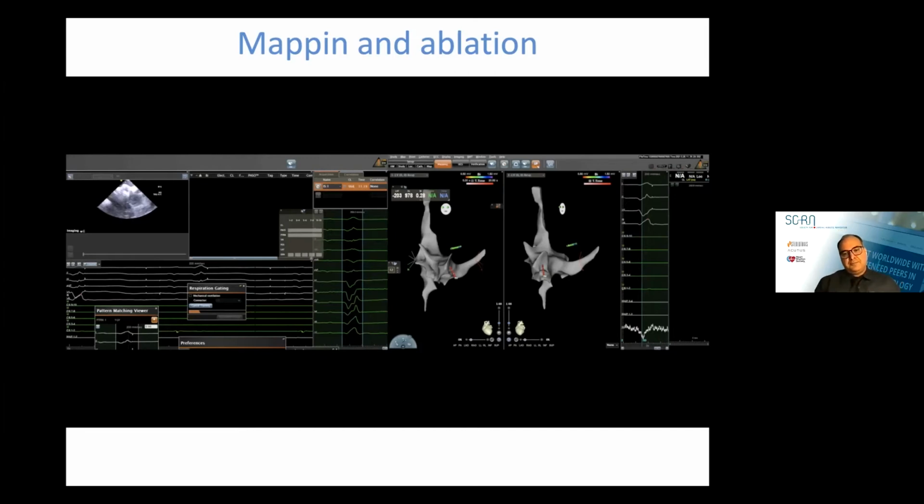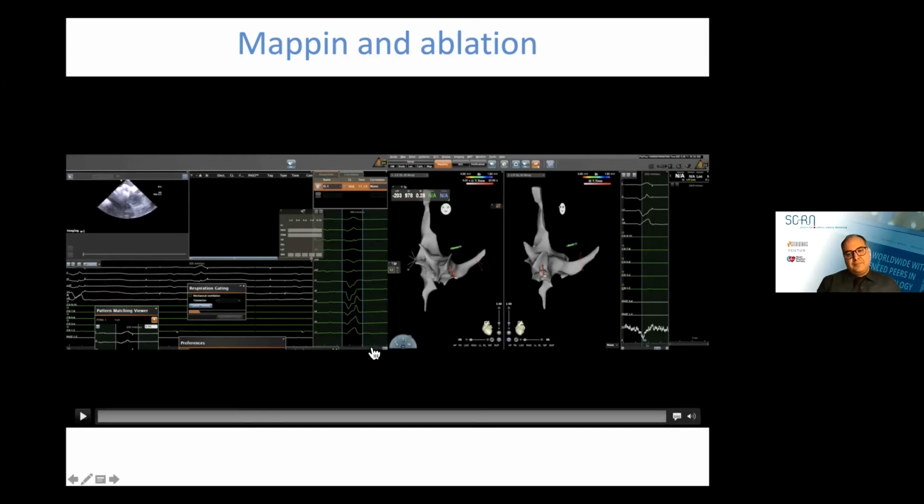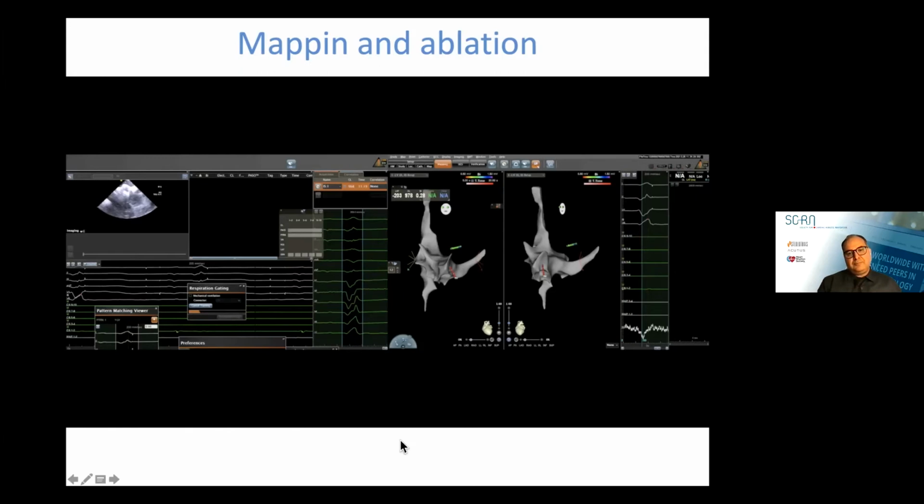So you must feel that a magnetic small electrode mapping catheter would be the perfect addition to your kind of workflow, right? Absolutely. Do the mapping itself also with small electrodes on the magnetic base. I believe that's sort of the next frontier. If the company wants to spend money, it's a diagnostic multipolar narrow lead space or small tip catheters where you can actually resolve these small voltages.